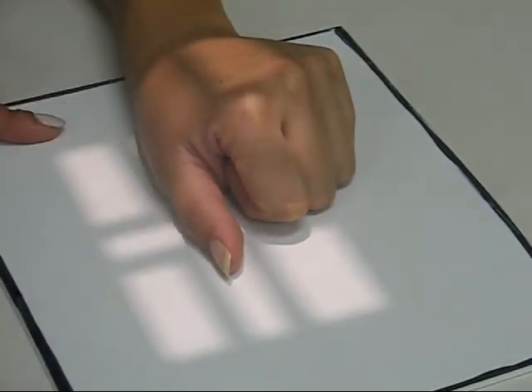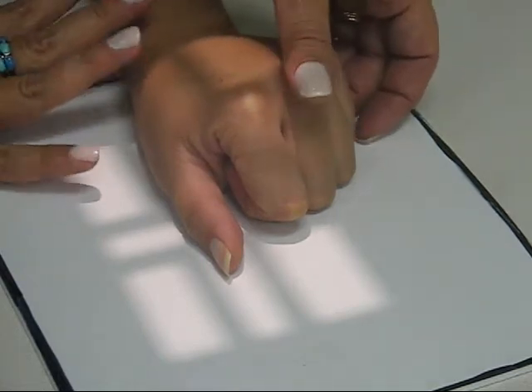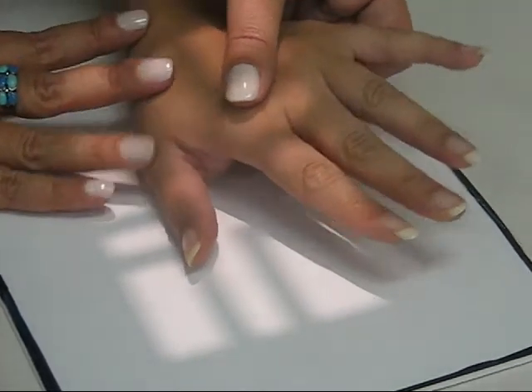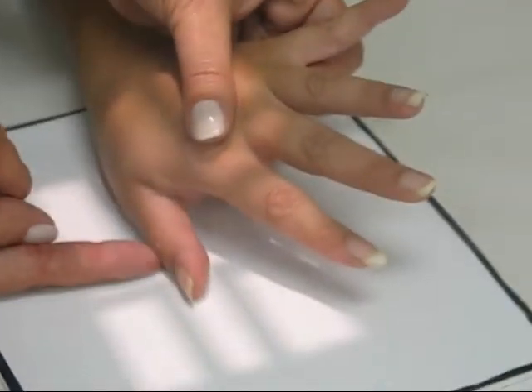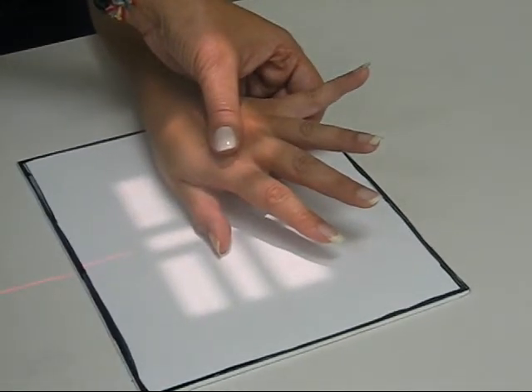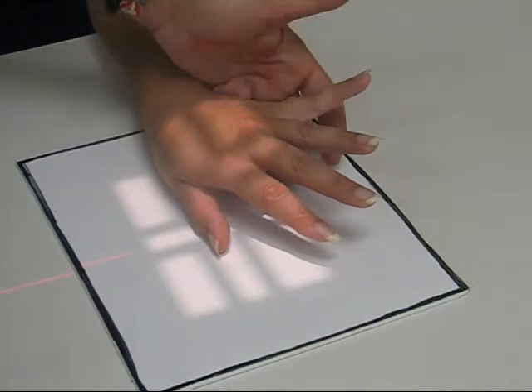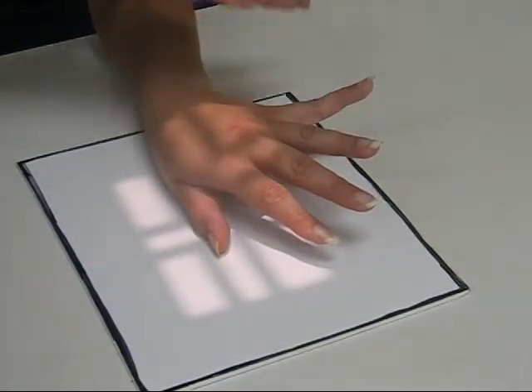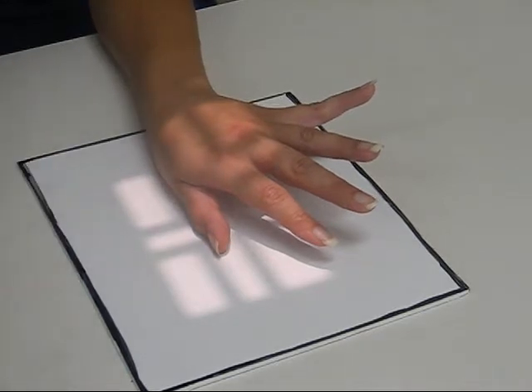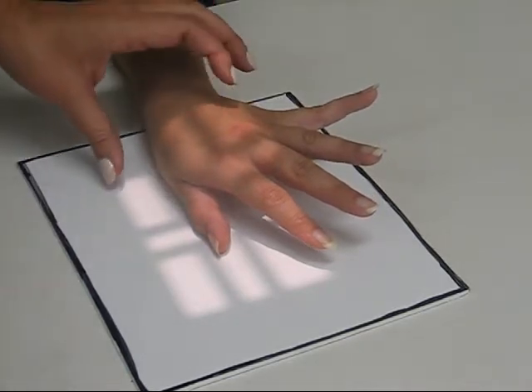If your patient cannot make a fist, they can still open up their hand. Just bring their hand up like that and make sure that you support it the whole time. You cannot do a lateral of the thumb and the whole hand at the same time, because there's no way to accomplish both things at the same time.